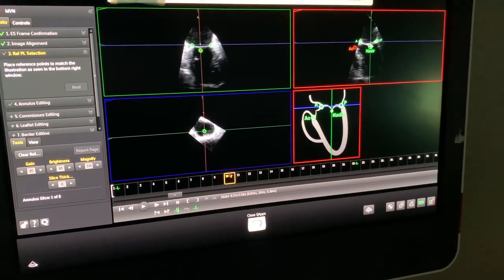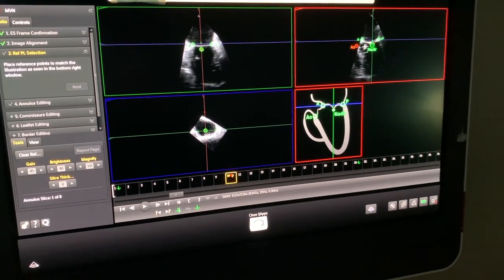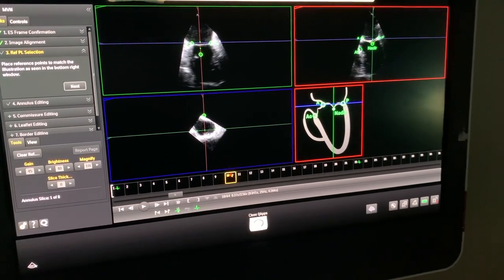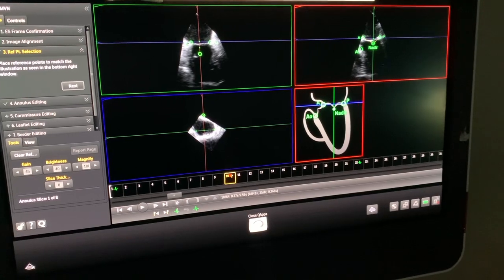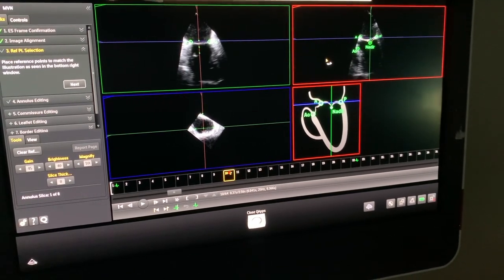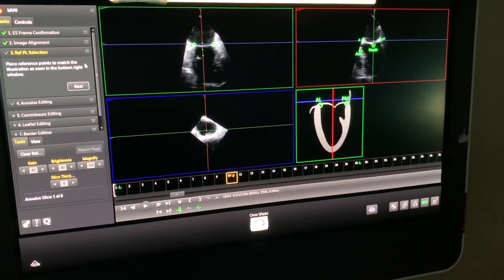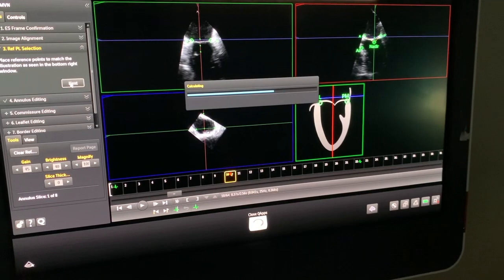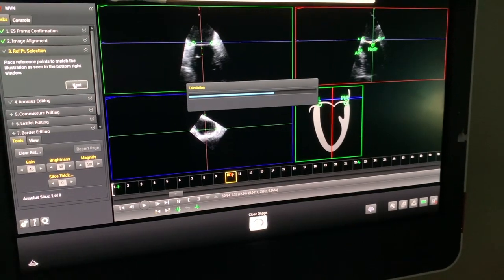We then put the nadir of the leaflets and the other part of the aortic annulus, which is very important for the aorta-mitral angle. And simply thereafter, you just click Next.